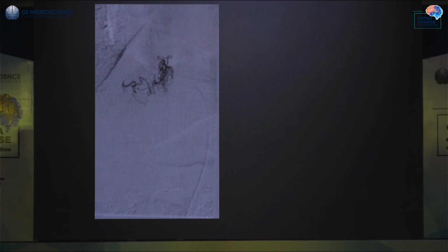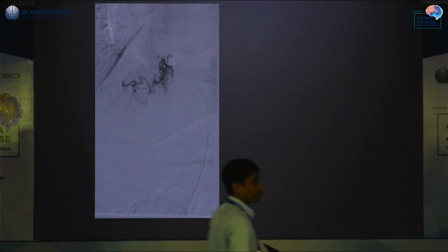When you get to one of the bends, which is the most critical bend, you just move it back and forth, having a positive pressure on your microcatheter, and your microcatheter usually flows through. Unless it's stuck in a branch or at a bifurcation point, it usually flows through. You don't have to get your micro wire all the way to the tip.